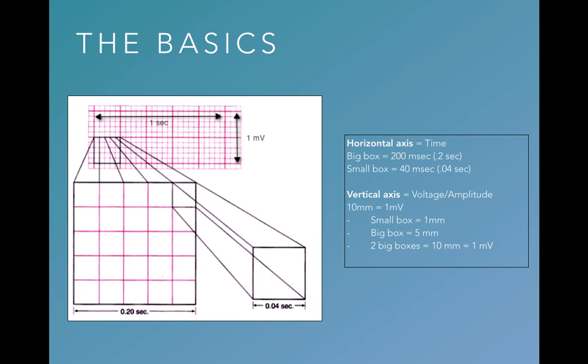So that's kind of irrelevant to this. But again, if you want to look up why that may be important voltage-wise, you can do that on your own time. The millimeters in height will become important when looking at things like left ventricular hypertrophy, but we'll get to that in the next lecture.